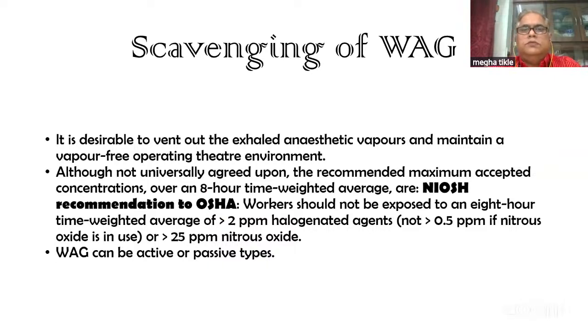Now coming to after we have done most of the things and we have seen how the workstation usually works, coming to the least desirable part and least used part in the anesthesia workstation, that is scavenging of waste anesthesia gas. Now, it is desirable to vent out the exhaled vapor and maintain a vapor-free operation theater because of occupational hazards that it poses. Most of them are seen in young females, like accidental miscarriages with high use of nitrous oxide, usually vitamin B complex deficiency. All these are there.